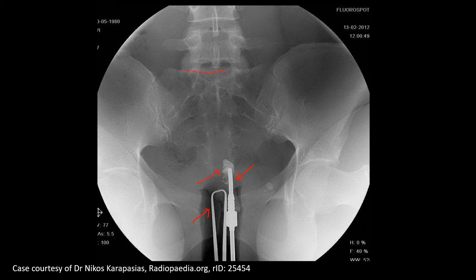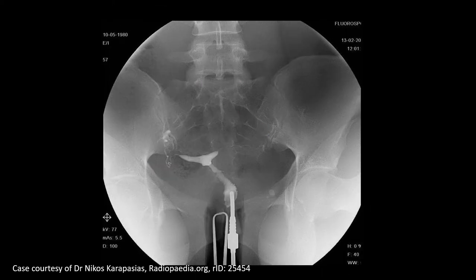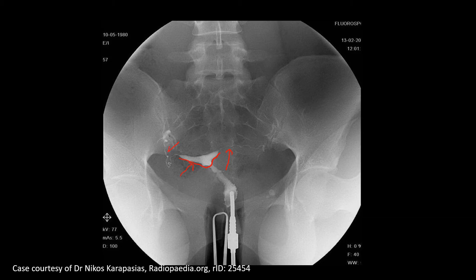This is the ala of the sacrum and this is the ilium, so this is the pelvic cavity. We will now inject the dye. You can see this small opaque shadow, which indicates the uterine cavity. Similarly, you can identify a thin white line on both sides — this thin white line indicates the cavity of the uterine tube. This is the lateral end of the fallopian tube.